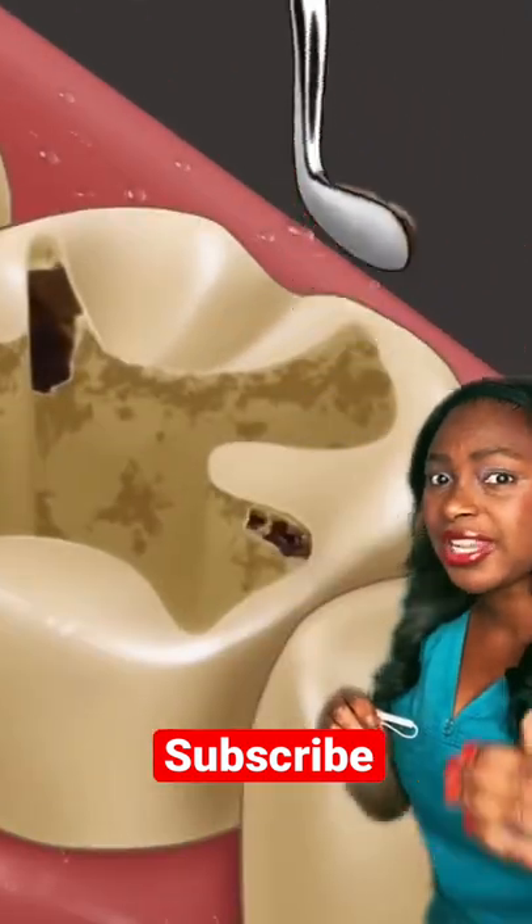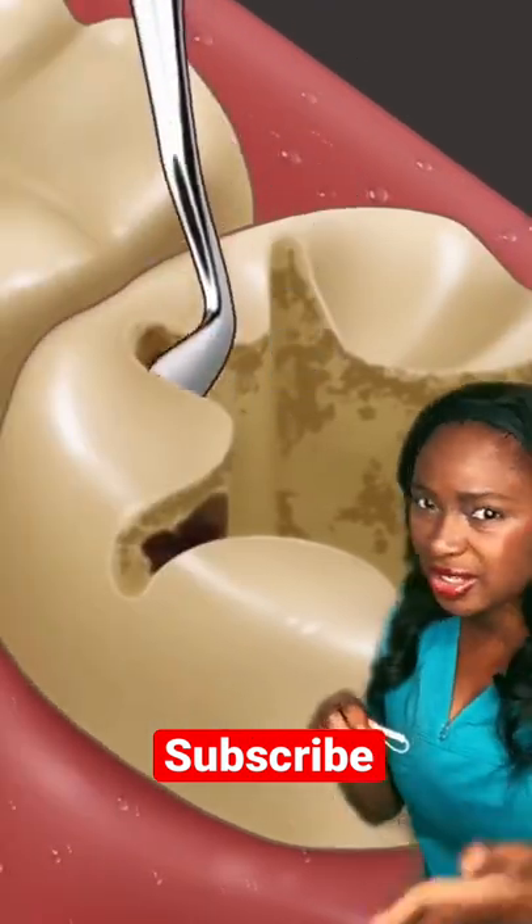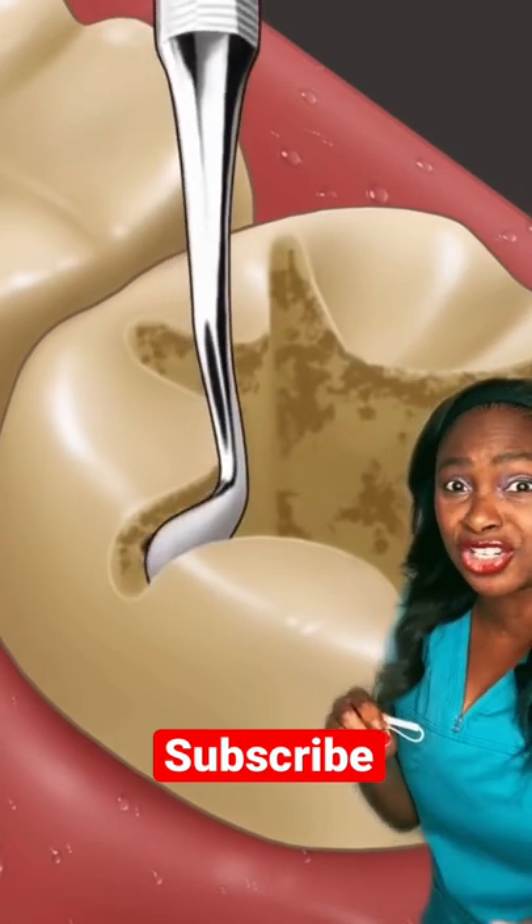Then they stop drilling and they want to hand scrape out whatever's left, so that way they don't drill into the nerve. They're doing a good job with this part.